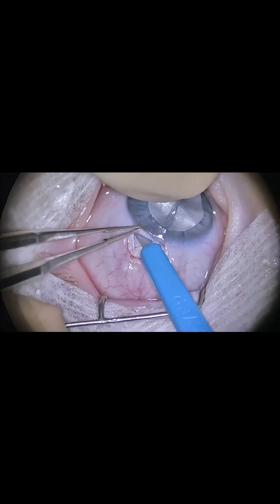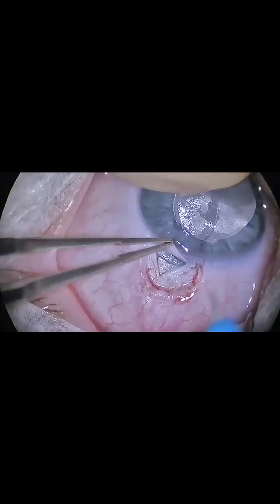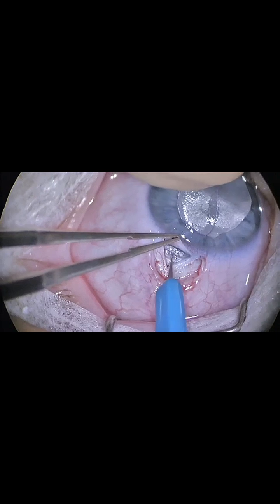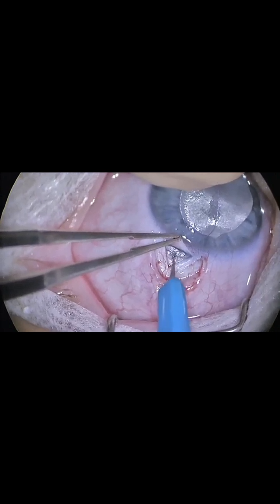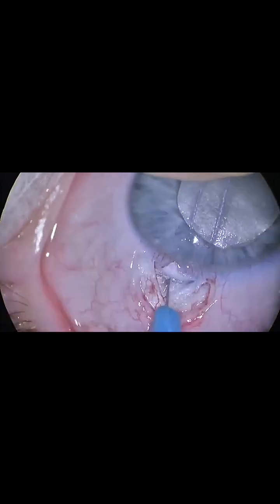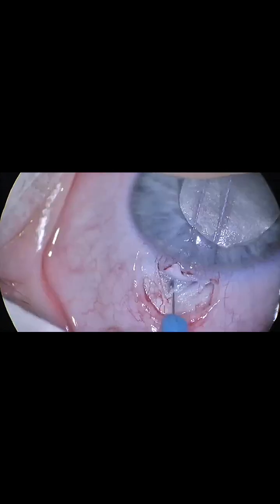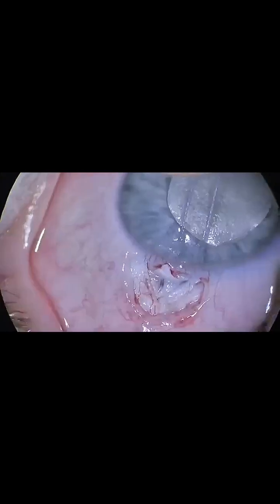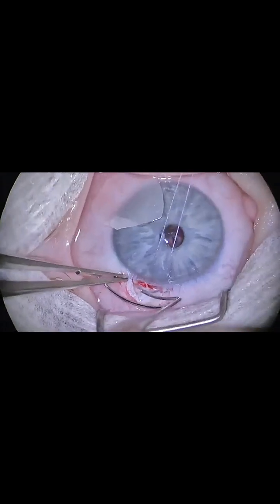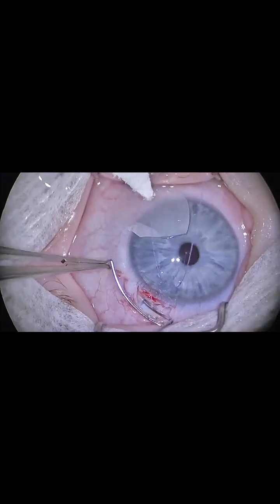Anteriorly, we are moving deeper to reveal Schlemm's canal. We then score posteriorly in a vertical fashion until we enter Schlemm's canal, which is noted by a slight flow of aqueous. The Harms trabeculotomy probe is then introduced in a left-facing manner. The probe is moved circumferentially along Schlemm's canal, which is visualized with the help of the external probe.